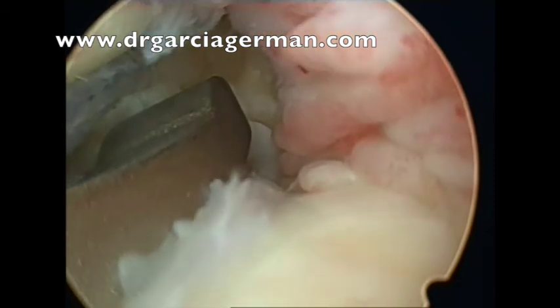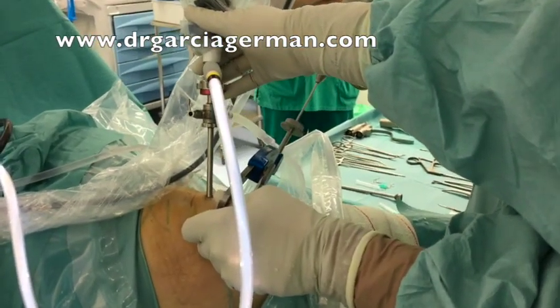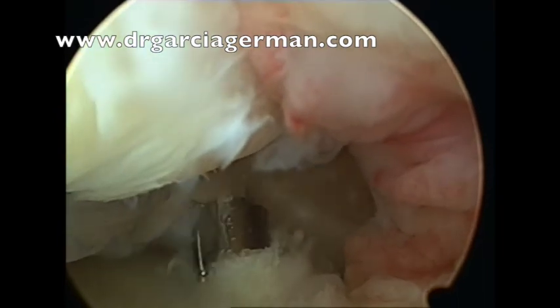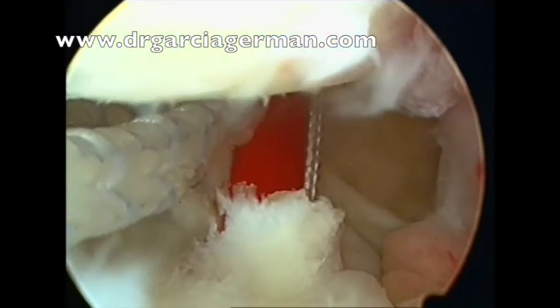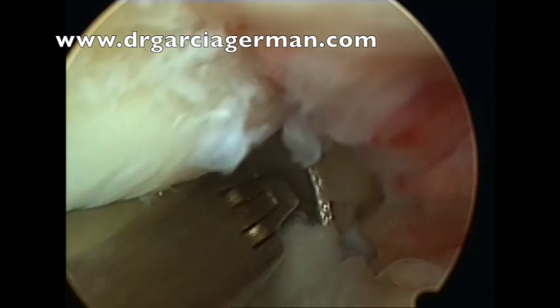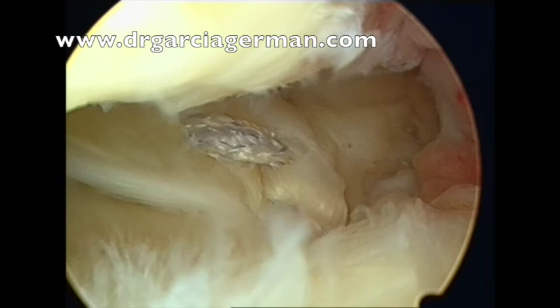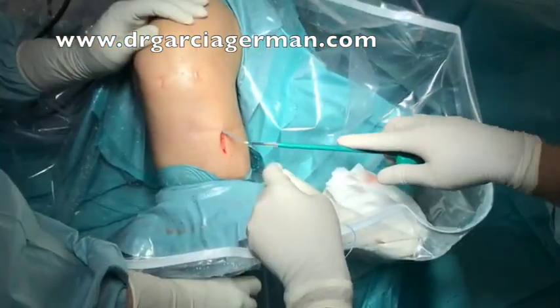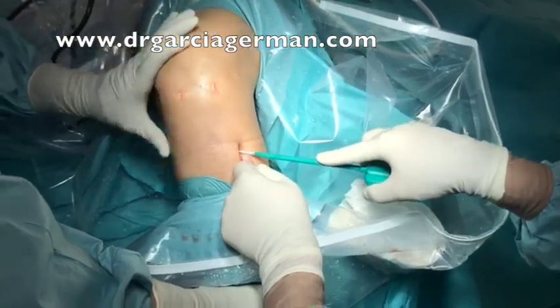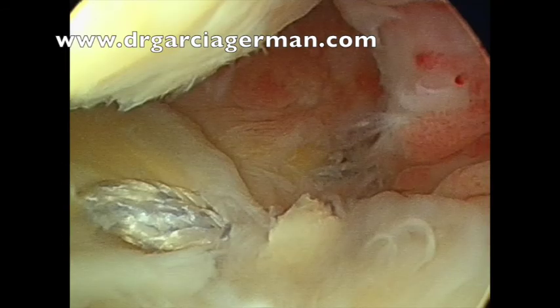We now use an ACL guide — there are specific and different guides available — and we drill from the contralateral side for better reinsertion orientation. We use a flip cutter to create a socket approximately eight millimeters in depth, and a passing suture to pull the tape down through the transosseous tunnel. As you can see, we can reduce the root very nicely. We no longer use a cortical button; instead, we use a swivel lock device to obtain a proper, secure, and more reliable tension on the fixation. This is the final view with a very nice reduction and reinsertion of the posterior root of the medial meniscus.